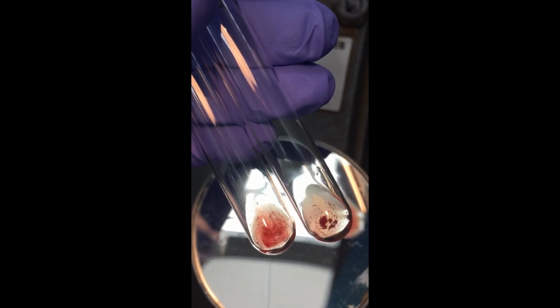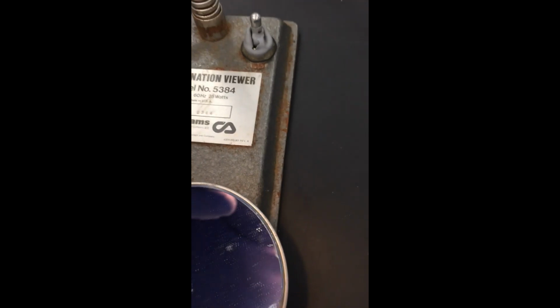And then, of course, here we have agglutination in tubes 1 and 2. Three and 4. 5. Good job.